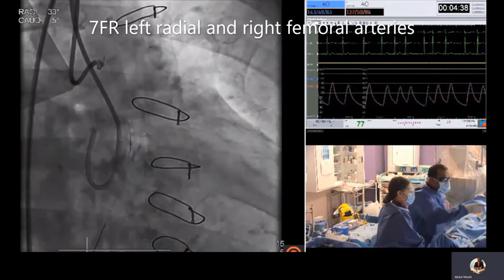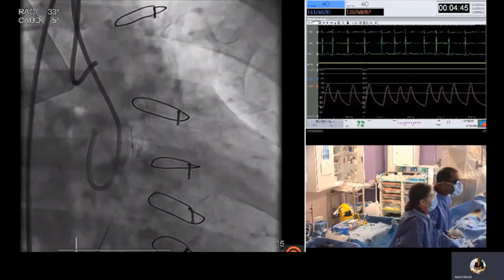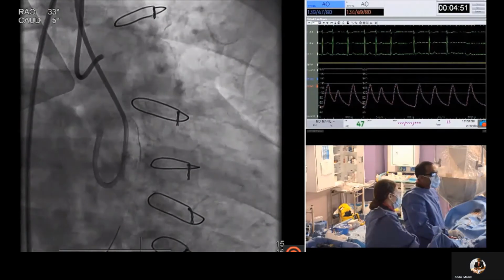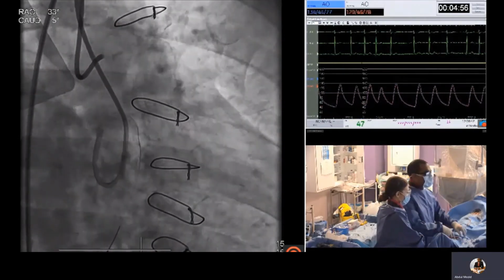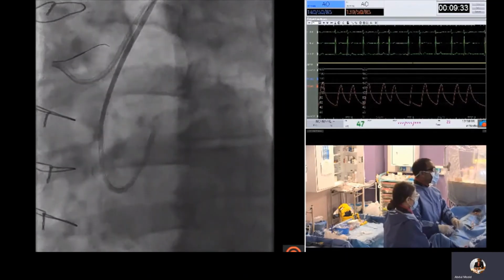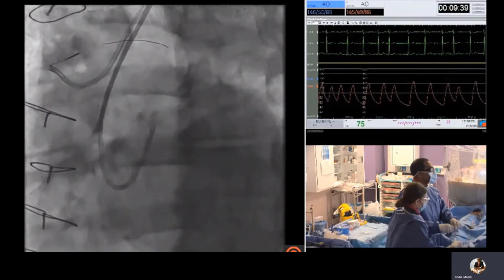It was then a surprise to find that in fact the vein graft had occluded in the interval period, having had attempted PCI around 6 weeks earlier. The patient's symptoms had actually deteriorated in these 6 weeks, consistent with this finding. So the challenge was now to try and recanalize the occluded graft and use this as a retrograde conduit.